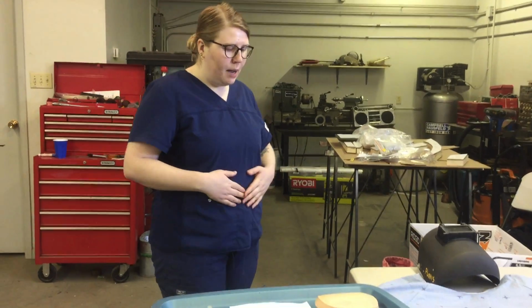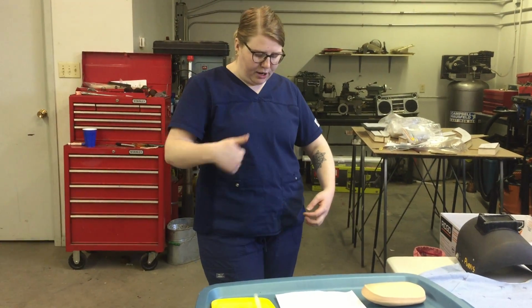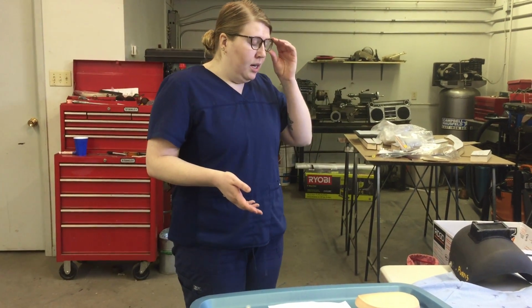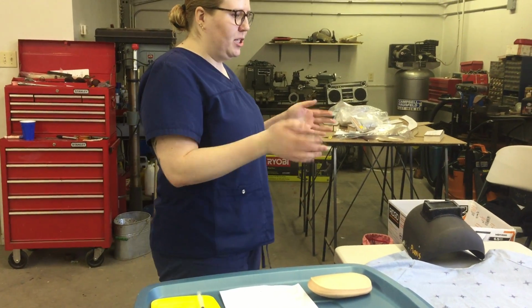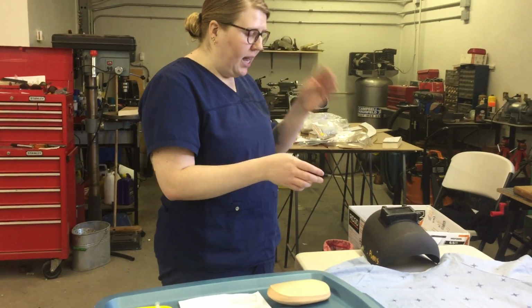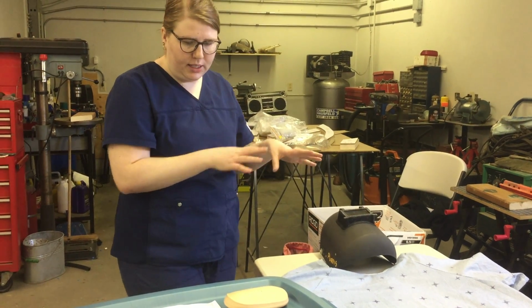After I've explained all that, I'm going to properly landmark. For this patient, I'm going to be landmarking 5 centimeters from his umbilicus, making sure to avoid any areas around the stomach that have bruising where a prior injection might have been given. After I have done the proper landmarking and the patient is okay with that, I'm going to raise the bed to the proper height for me to give the injection, and I'm going to expose the patient's stomach so that I can landmark where I said, so we've chosen the right spot, a clean area of skin.